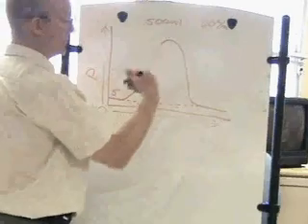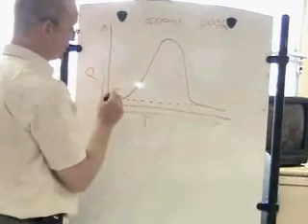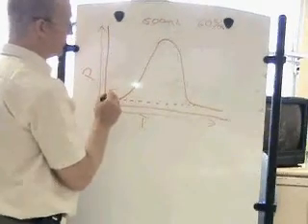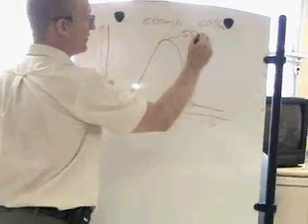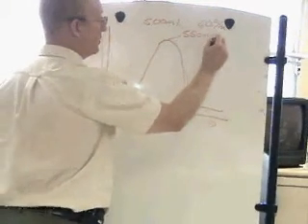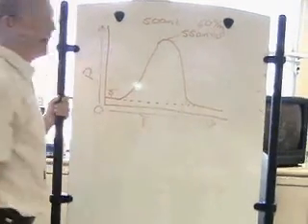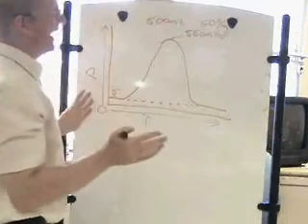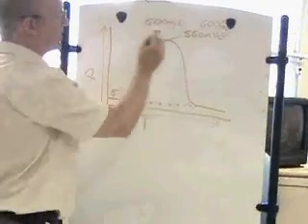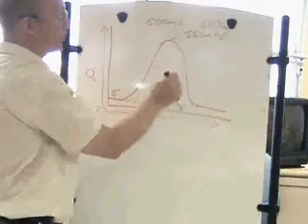Okay? From this model so far, all that we would know is that the PEEP level is 5, and my peak inspiratory pressure in this example would be 55 centimeters of pressure. Which some people would say is high. So since this is high, you have to ask yourself, well, why is it high? And the first thing to do in volume ventilation is to do an inspiratory pause.